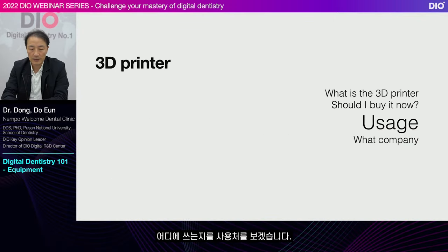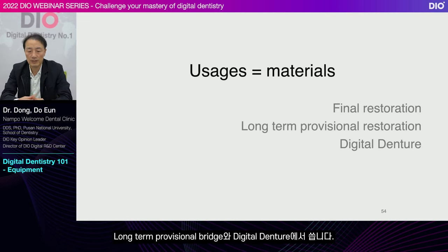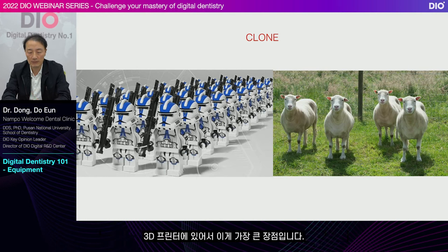Let's look at where it can be used. The usage depends on what materials there are out there for 3D printers. This one is used for final restoration. It's also used for long-term provisional bridge and digital denture. I call this the clone. You can repeatedly make copies. This is the greatest advantage of 3D printers.